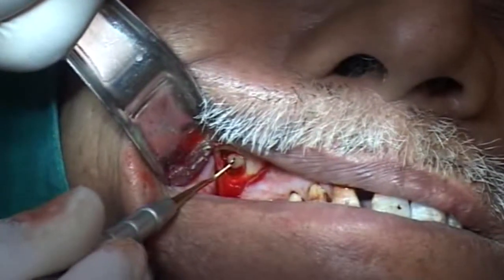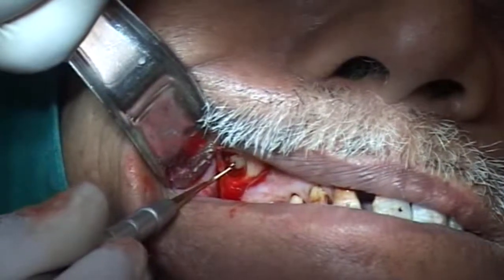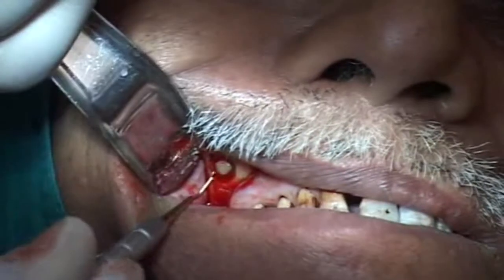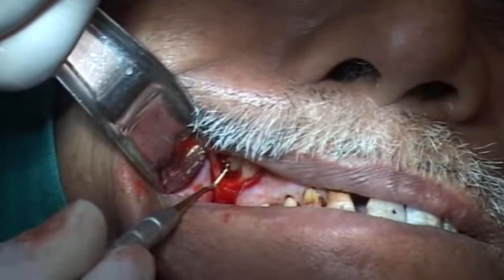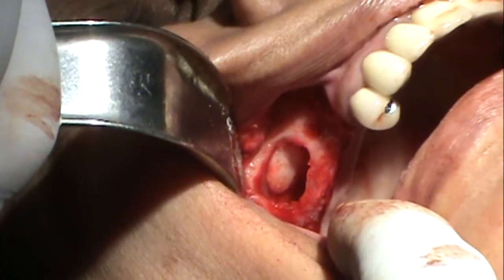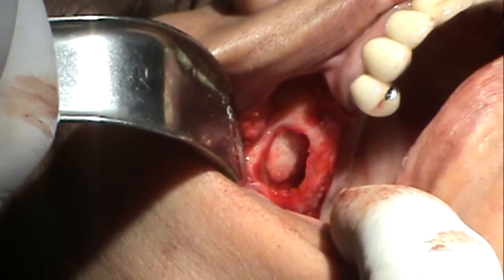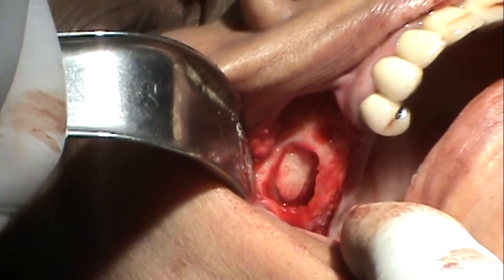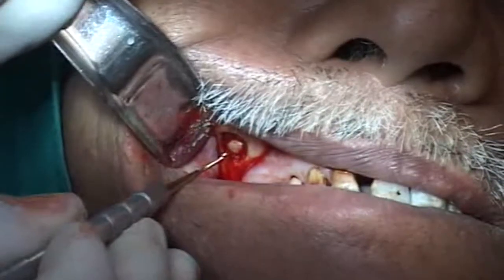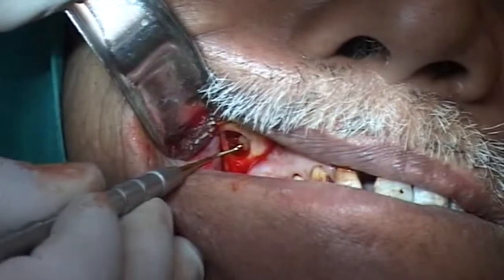Once separated, we gently and patiently push the small bone piece inside the sinus. This maneuver further separates the schneiderian membrane from the bone. The schneiderian membrane is very delicate and any direct manipulation can perforate it. We should always check whether our schneiderian membrane balloon is perforated or not: we ask the patient to inhale and exhale. When the patient inhales, the bone piece and schneiderian membrane go inside; when exhaling, they come outside. This means the schneiderian membrane balloon is not fractured, not punctured.